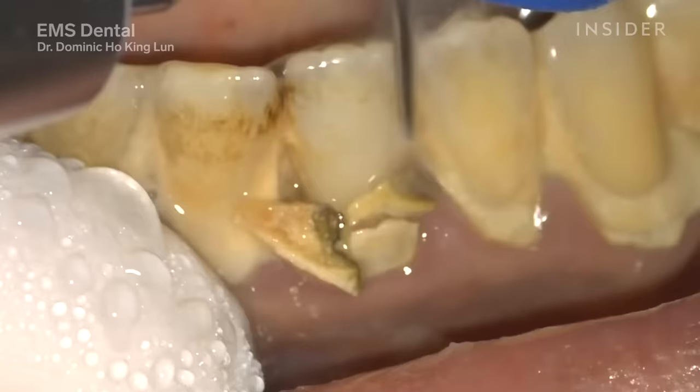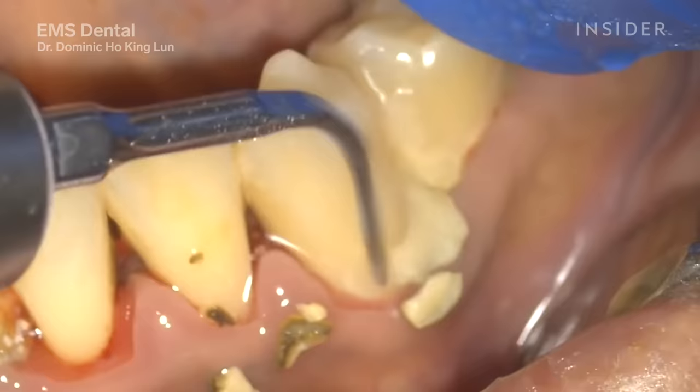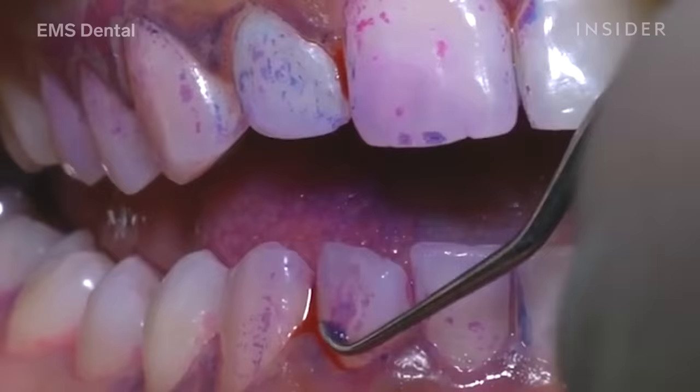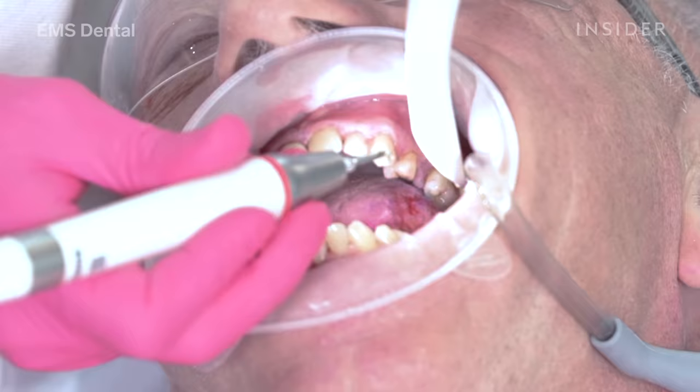After we've disrupted all of the biofilm and removed all of the stains, Piezon No Pain is used at this stage. It uses ultrasonic vibrations to remove any remaining hard calculus, shaving it off very gently. It's very different to the old-fashioned methods of scraping the teeth, which would take calculus away but would also scratch the tooth surface.